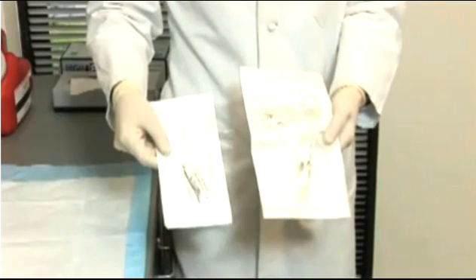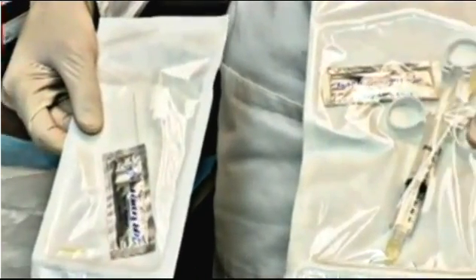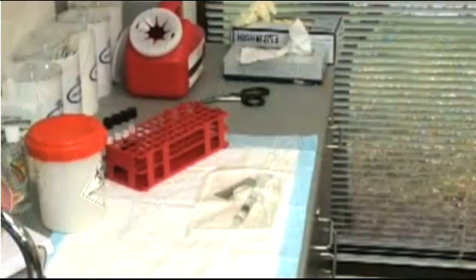When collecting a nasopharyngeal aspirate, you'll need a bulb-style aspiration kit or syringe-style aspiration kit. Once you have the necessary supplies on hand, you can collect the specimen.